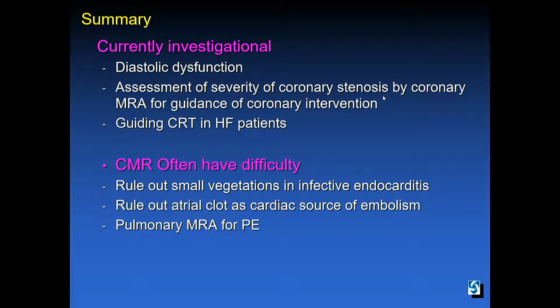And often MRI is difficult in ruling out very small structures like vegetations, especially when attached to a moving valve. MRI has difficulty telling whether it's a vegetation or a small clot when the structure is very small and moving.